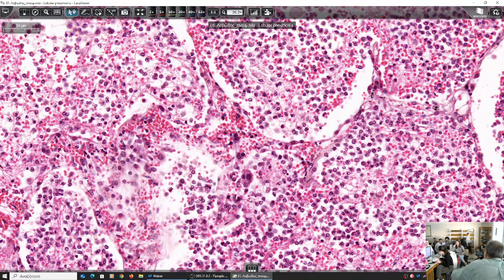Now, let's identify the constituents of the inflammatory infiltrate. Who wants to come with me? Come, please. Yes, please come and sit here, and we'll find them together because we have the interactive way. Not the monologue. So, what's your name? Nikos. Come, sit, Nikos.